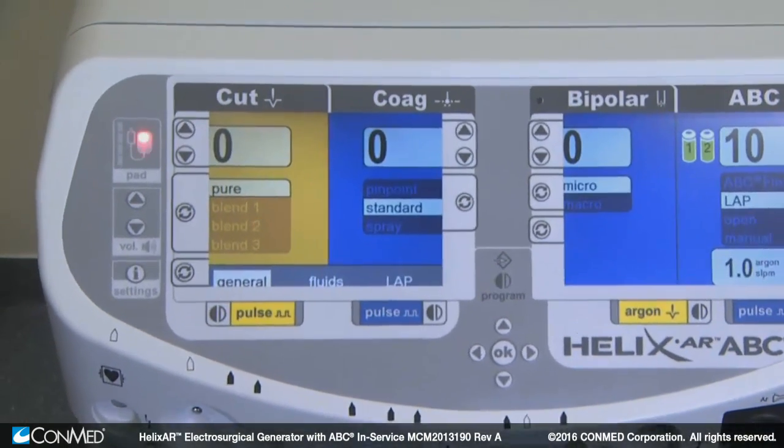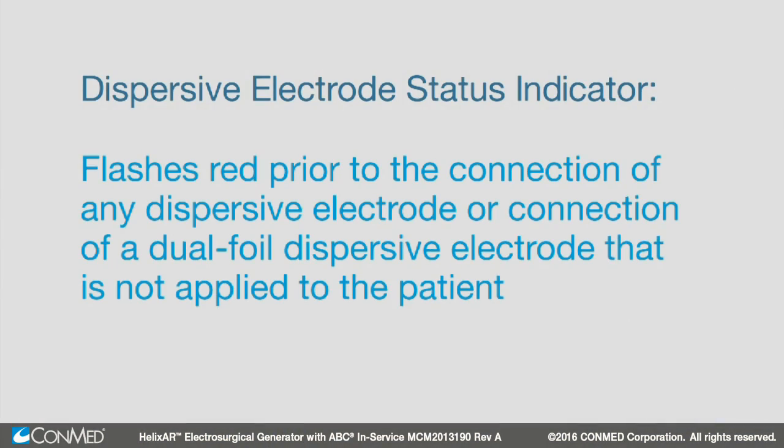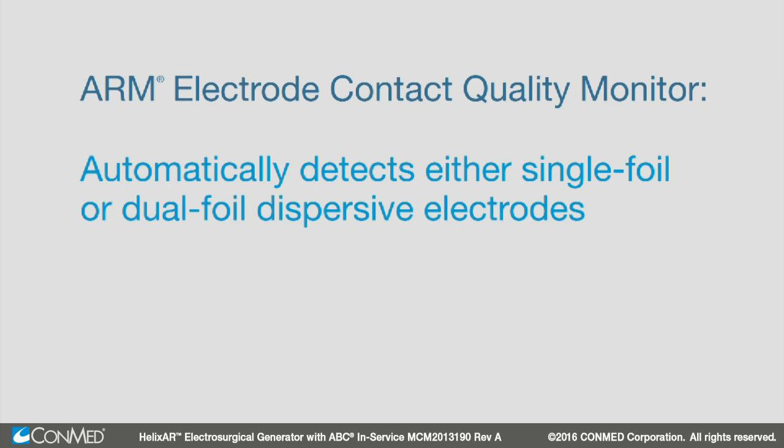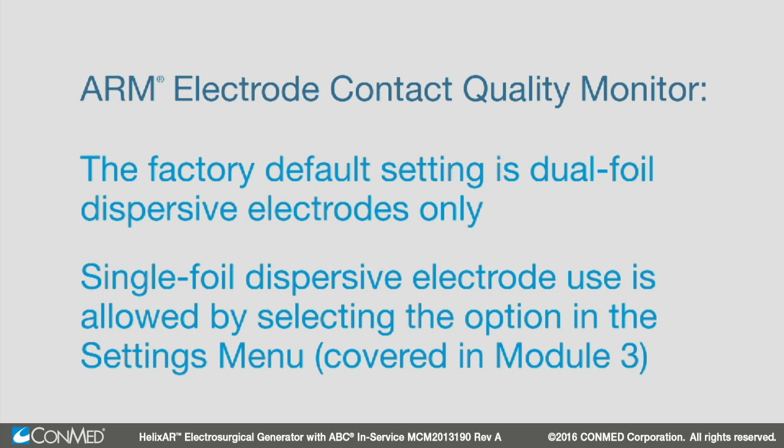Moving to the top left of the generator, you'll find the dispersive electrode status indicator. This flashes red prior to the connection of any dispersive electrode, or connection of a dual-foil dispersive electrode that is not applied to the patient. ConMed's ARM dispersive electrode contact quality monitor automatically detects either single-foil or dual-foil dispersive electrodes. The factory default setting is dual-foil dispersive electrodes only, but single-foil dispersive electrode use is allowed by selecting the option in the Settings menu, which is covered in Module 3.